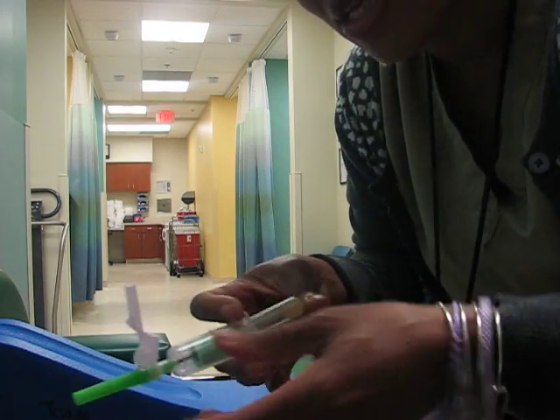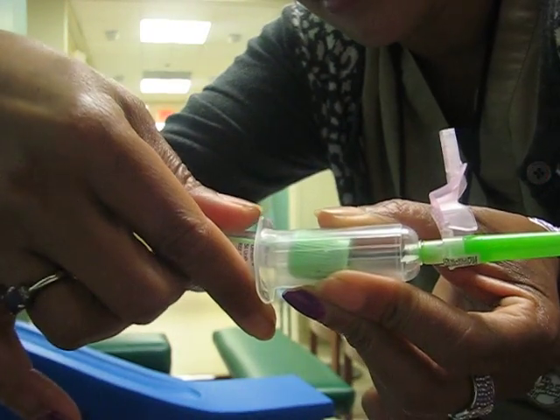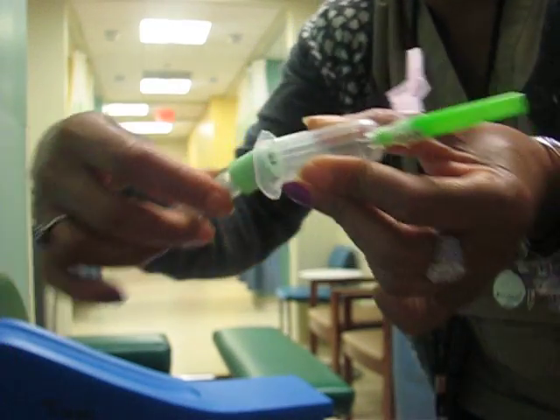I wanted to go over that because it's important — it's a really, really good hack, trick, whatever you want to call it. It's just a way for you to stabilize and to avoid hurting the patient. And all the years I've been doing it, it's been working for me — even switching hands. As you saw, I stick with my right and then I stabilize with my left.